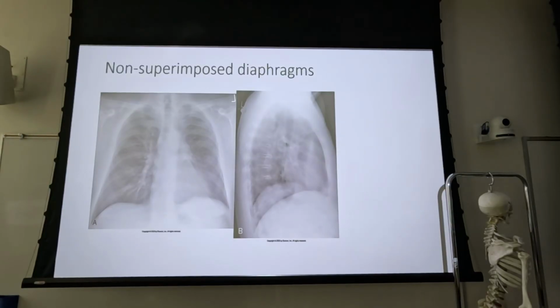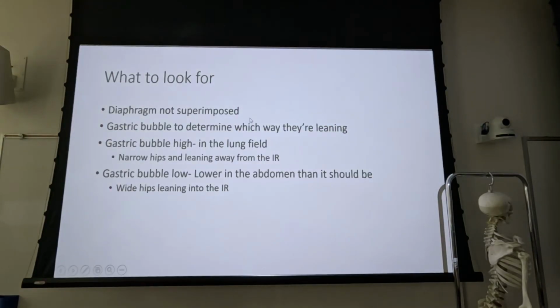What are the two conditions that you might use this specific instruction for? Inspiration, expiration, chest X-ray, exactly. The radiologist might want to follow up and say, I want to see an inspiration, expiration chest X-ray to see if this diaphragm moves very well. If they're directly across from each other, then you're going to have that separation on the lateral. Just can't get around it.